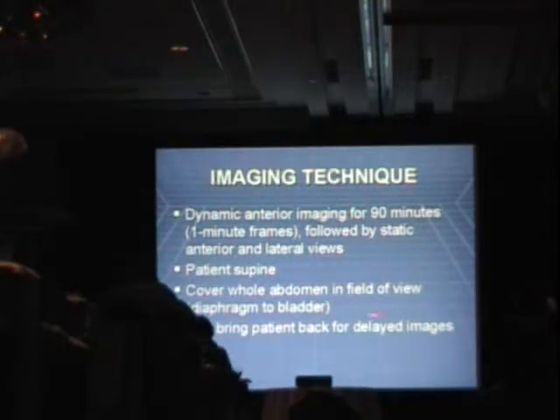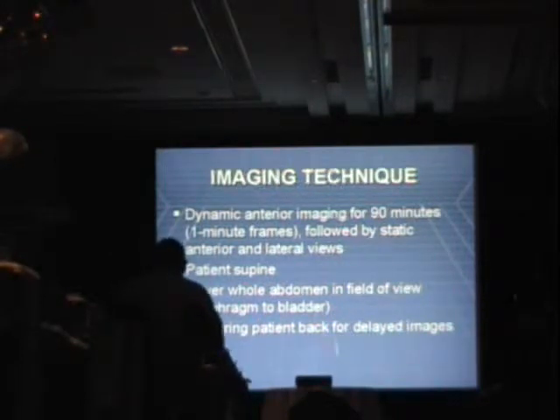Patient is supine. The whole field of the abdomen needs to be in the field of view. That means from the diaphragm to the bladder, including the rectum behind the bladder. You have to make sure they're positioned correctly for that.